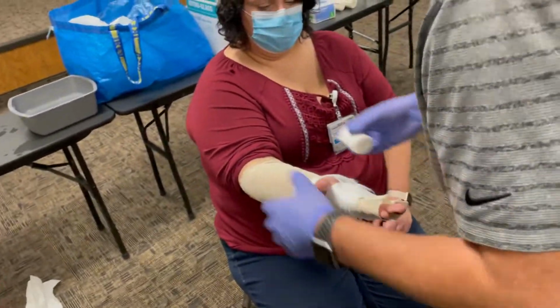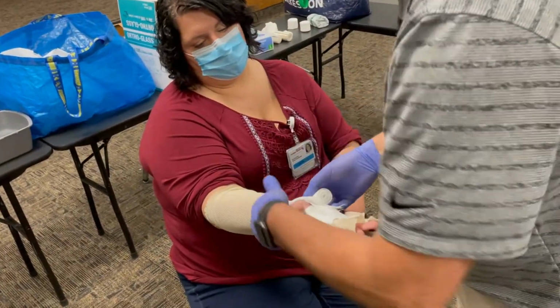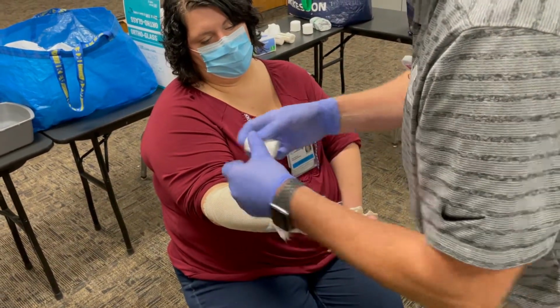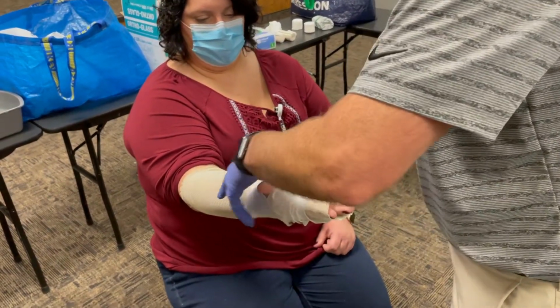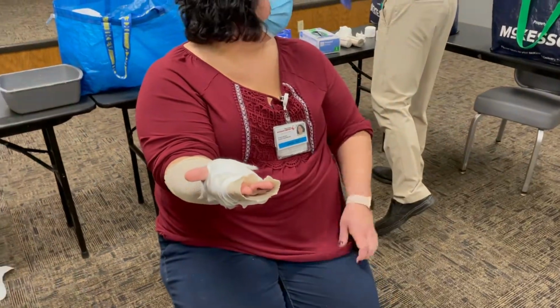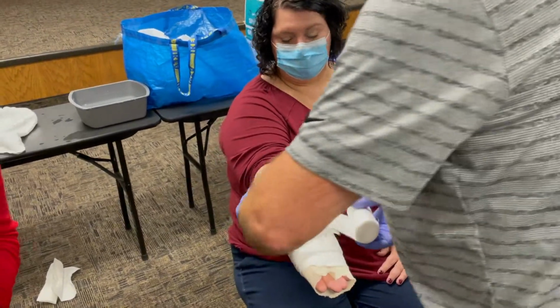I do a lot more padding on the plaster than I do fiberglass. Because remember, the plaster has no padding built into it. All right, and then we're just going to go around and around. For the people who like numbers, what do you think? 6 layers? Yeah, I'd say at least 6. So plaster 6 to 10.